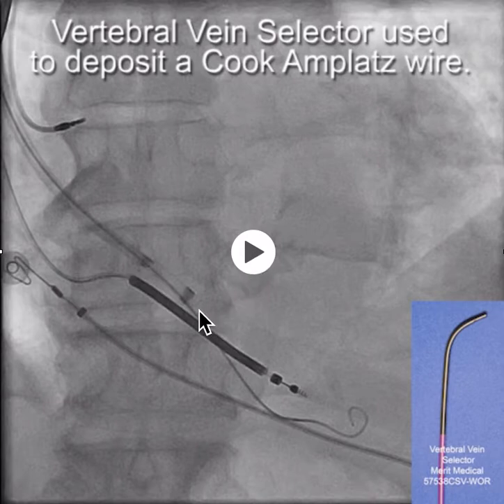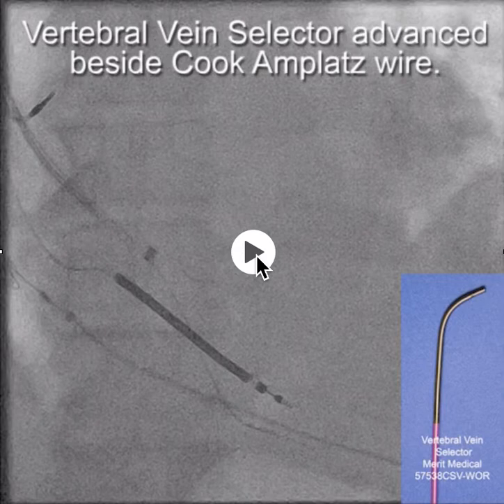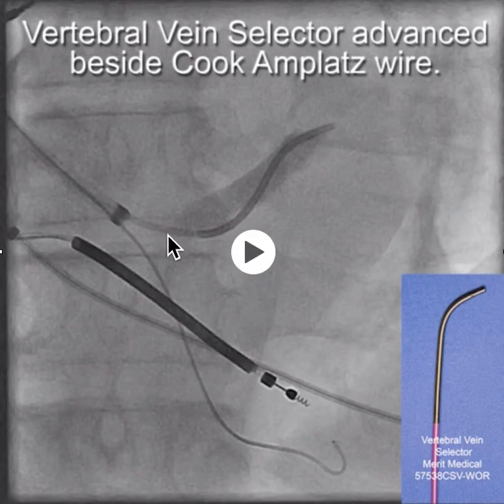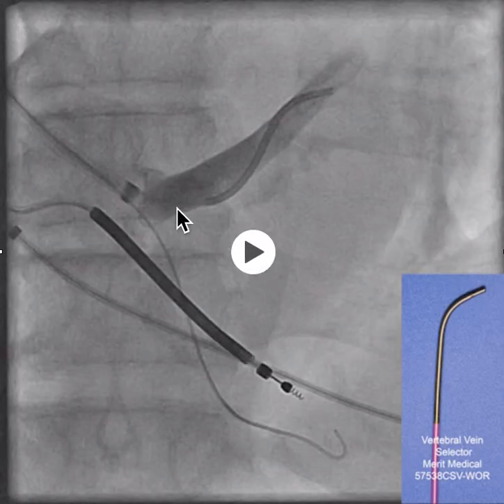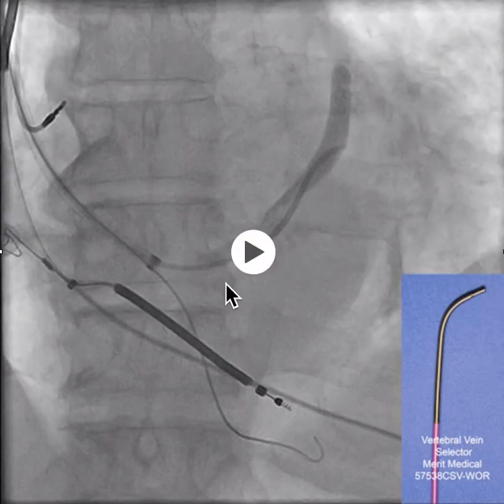Once we get to this point, we now have the Amplatz wire stabilizing the sheath in the middle cardiac vein, and we'll take out the braided core. Now with the Amplatz wire here, we'll advance the vertebral-shaped vein selector beside the Amplatz wire, and with that we're able to engage the true CS with the vein selector. We then take the vein selector up into the coronary sinus, and you'll note that there are no lateral wall branches off the CS in this area, because this part of the left ventricle is being drained into the middle cardiac vein.